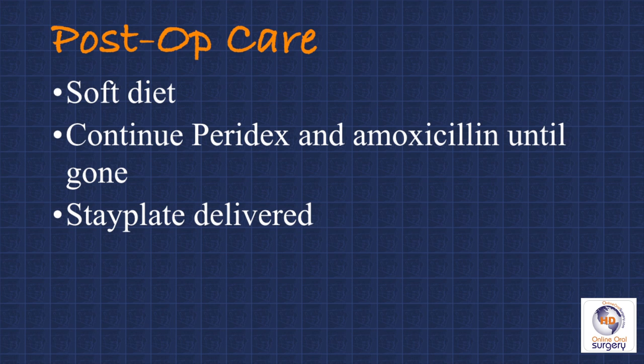Postoperatively, our patient's going to continue the chlorhexidine rinse and amoxicillin until it's fully gone. He's going to stay on a soft diet for about 6 weeks. We'll see him the following day to adjust his stay plate and instruct him to leave it out at night. His sutures will be removed at 2 weeks post-op, and then he'll be monitored for about 4 months. And at that point, he'll be evaluated for uncovering the implants and placement of healing abutments, and then eventual restoration.